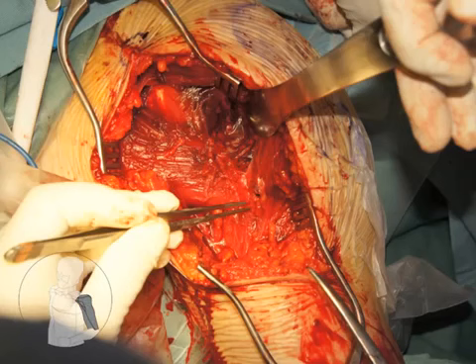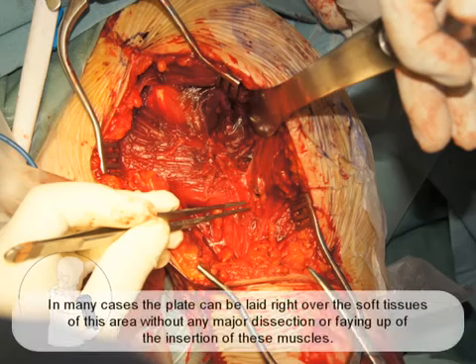Looking deeper, we see the positioning of a retractor below the deltoid. We see the organized hematoma in the area of the fracture site, and we see a deltopectoral interval down the space between the deltoid and pectoralis insertion. In some cases, this may need to be mobilized, but in many cases, the plate can be laid right over the soft tissues in this area without any major dissection or freeing up of the insertion of these muscles.